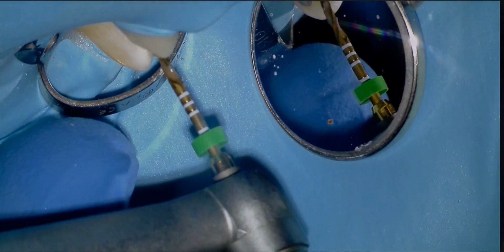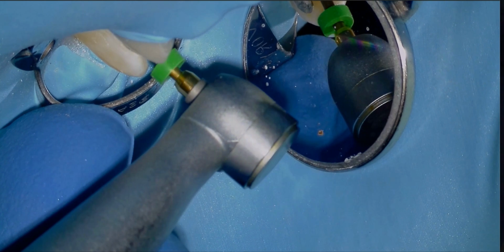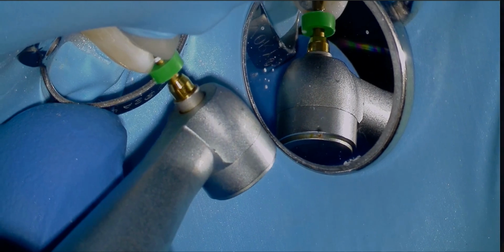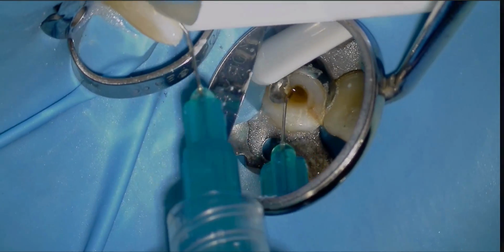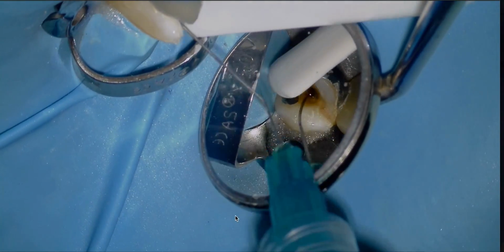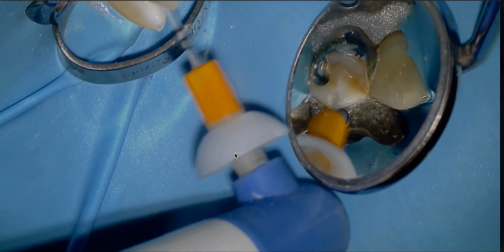So what I'm going to do now is open that up to 35/06, and you can see here that my 35/06 medium is going to working length, which I'm happy about. So that's great. We're going to irrigate a significant amount, and that's really what is going to solve this case. It's not only doing the mechanical shaping, but it's a chemical clean.